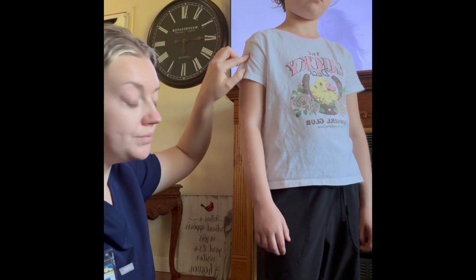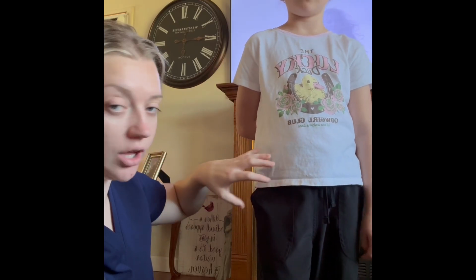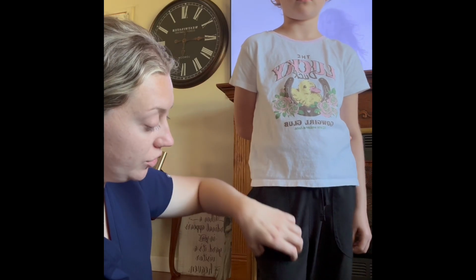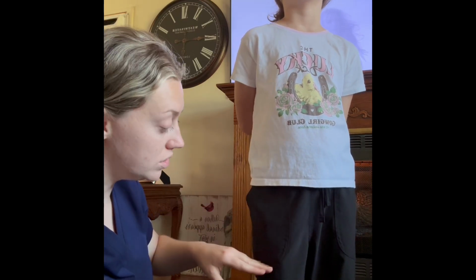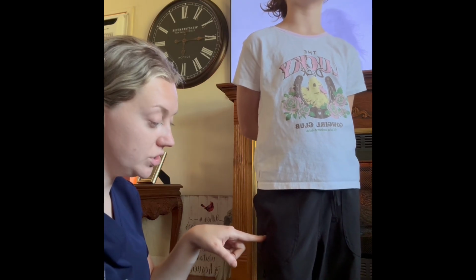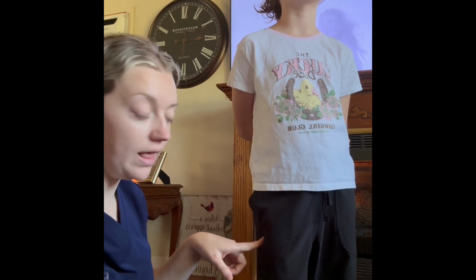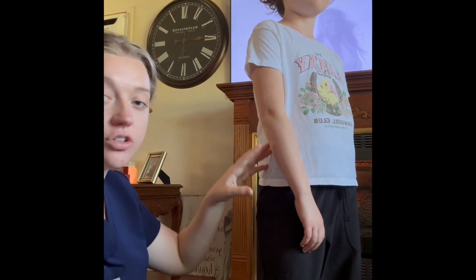of that triangle. I could do the vastus lateralis, which I would locate by creating an imaginary grid on the patient's leg, dividing it into thirds vertically as well as horizontally. So for that, I would want to inject into the vastus lateralis here, which is the outer middle third of the leg. And then the last one would be the ventral gluteal site.